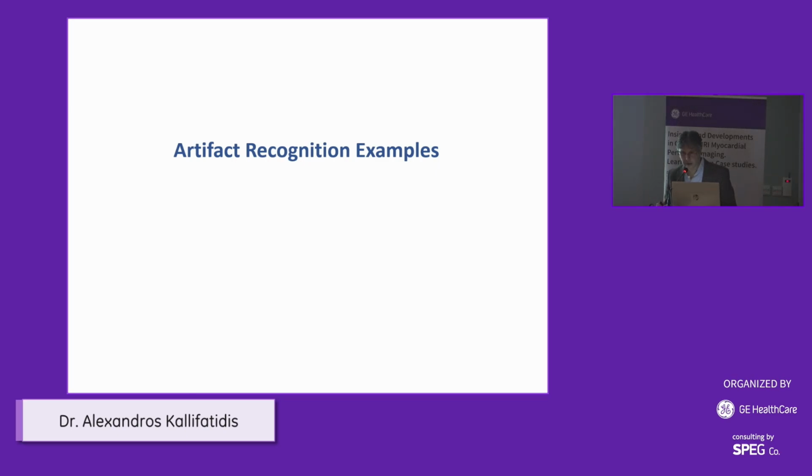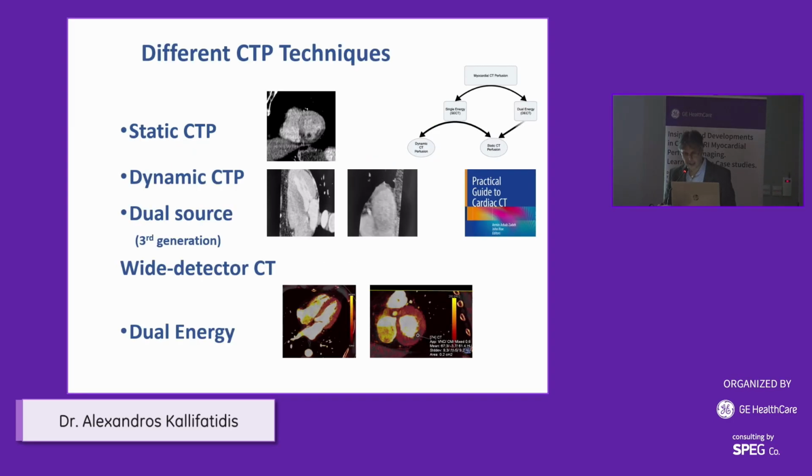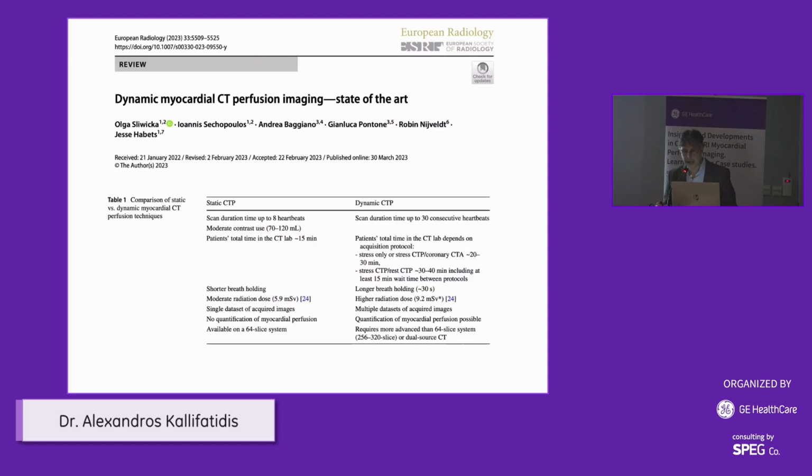I think I have 5 minutes, Thanos, for the CT. Very fastly, Kostas already covered quite a lot of the artifacts that we are facing with stress CT perfusion. There are different techniques, static, dynamic, dual energy. We can face different artifacts.